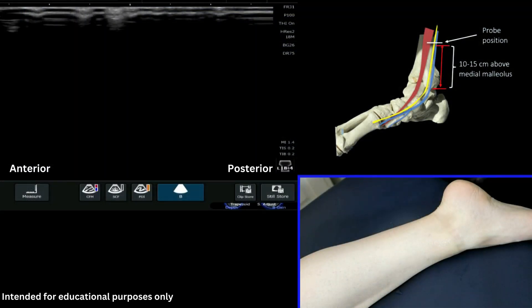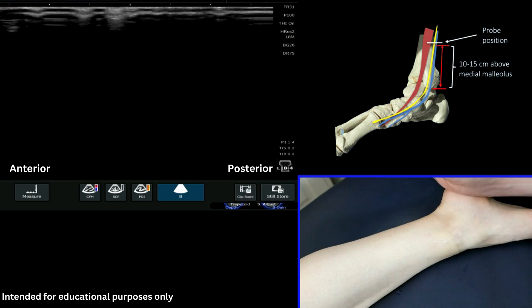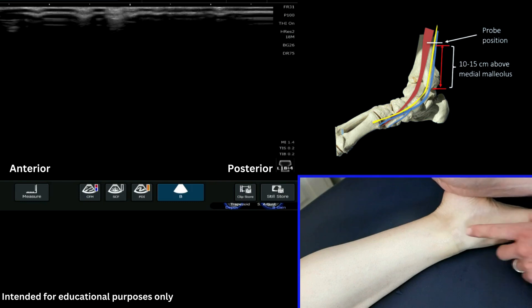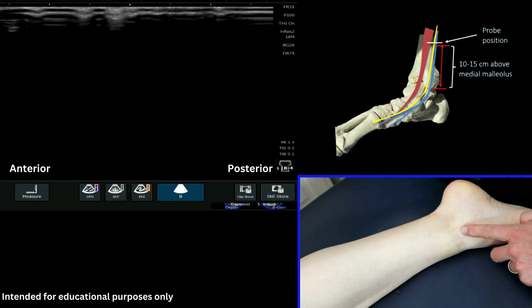We're now going to have a look to see if we can identify the saphenous nerve on the medial aspect of the lower leg, just proximal — 10 to 15 centimetres proximal to the medial malleolus here.